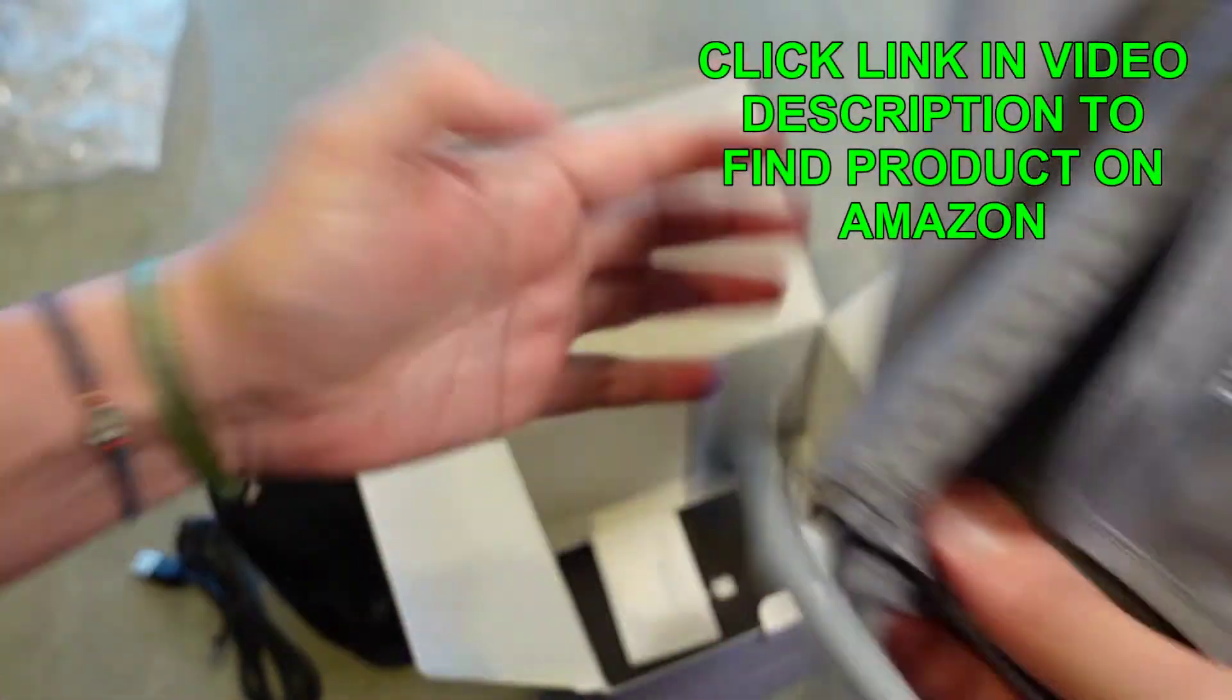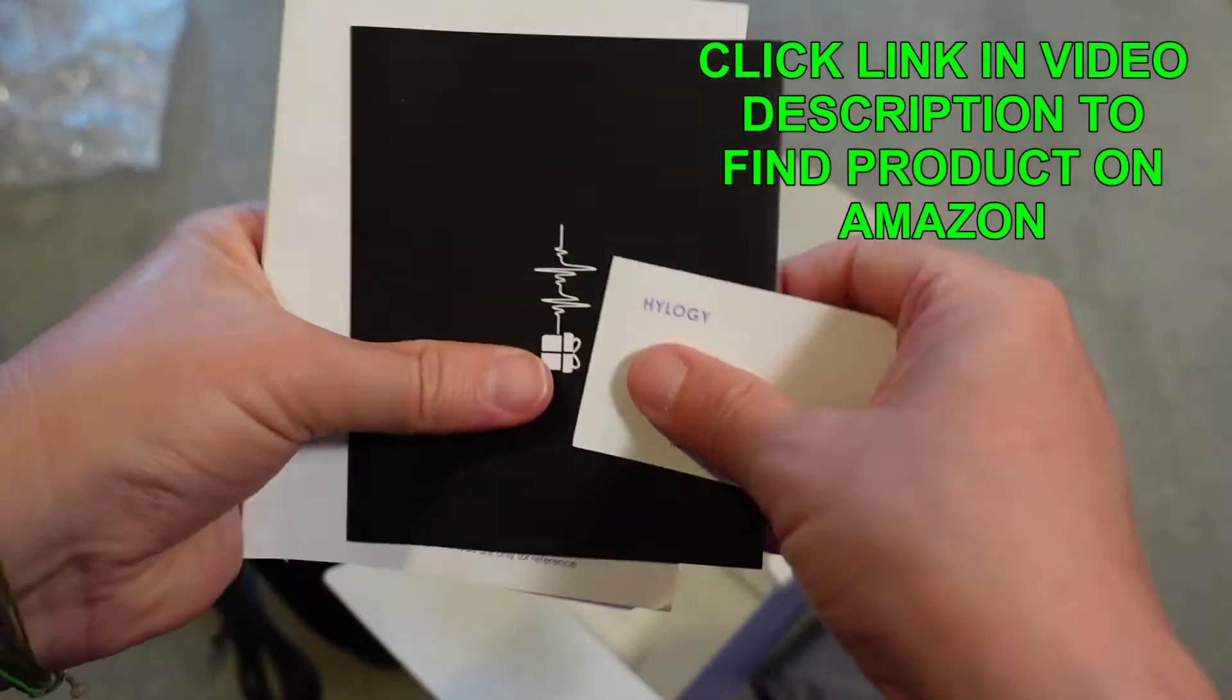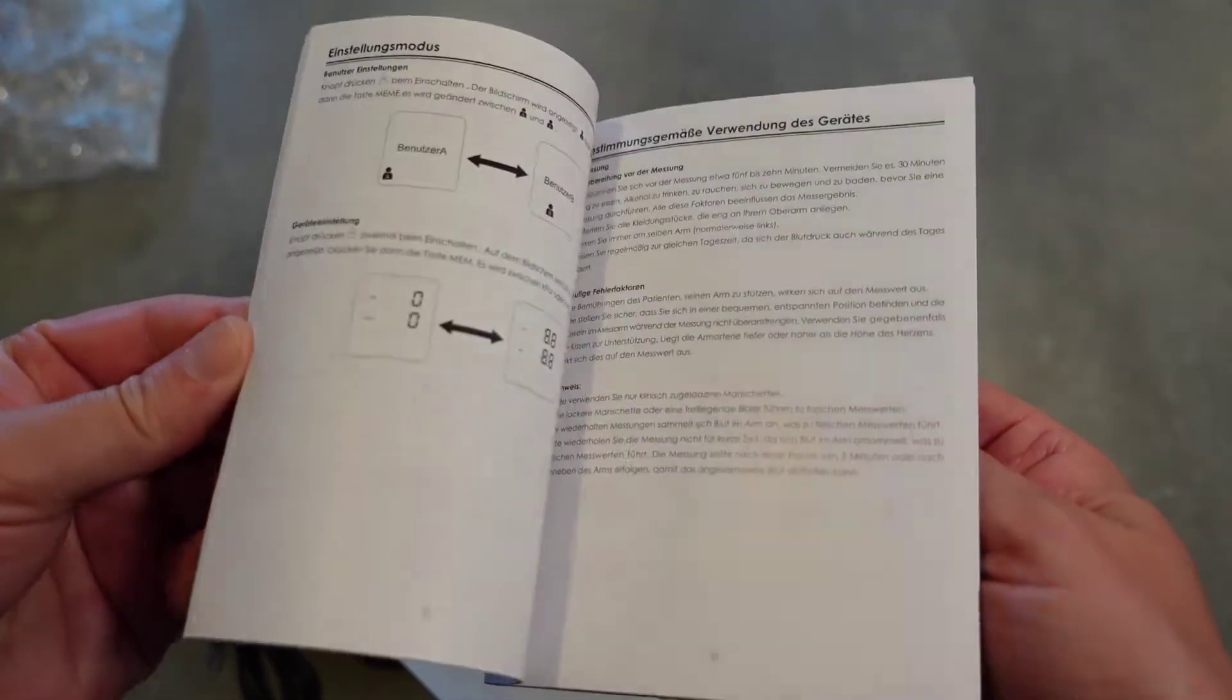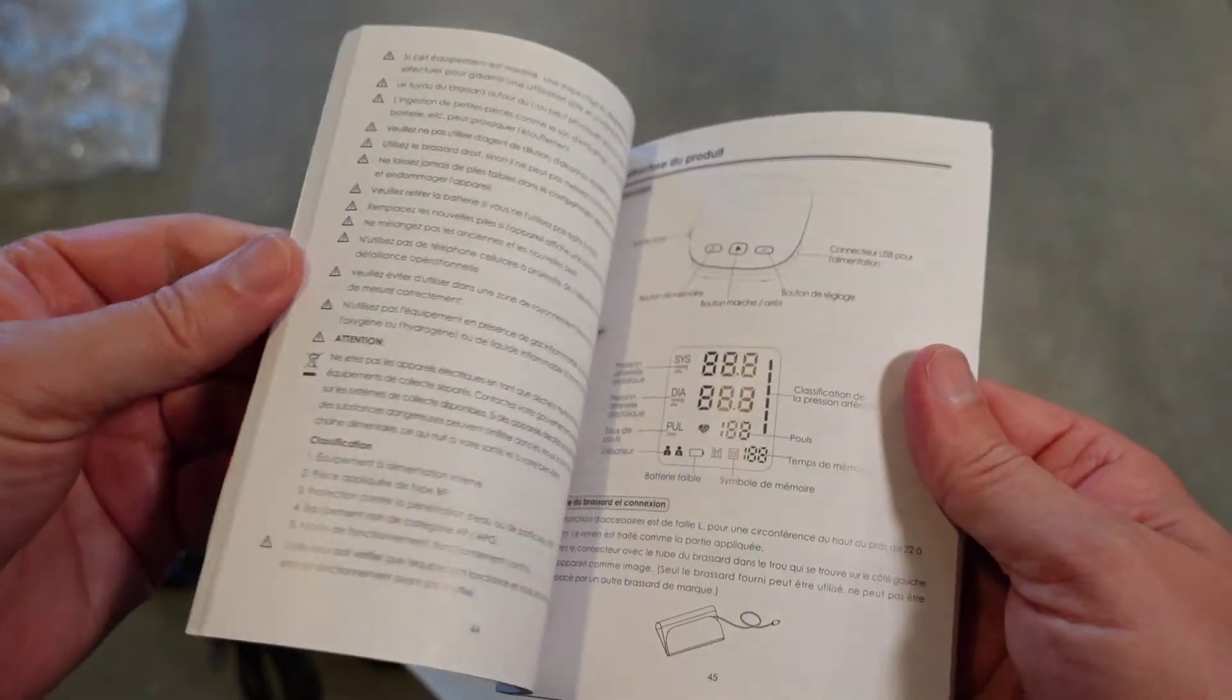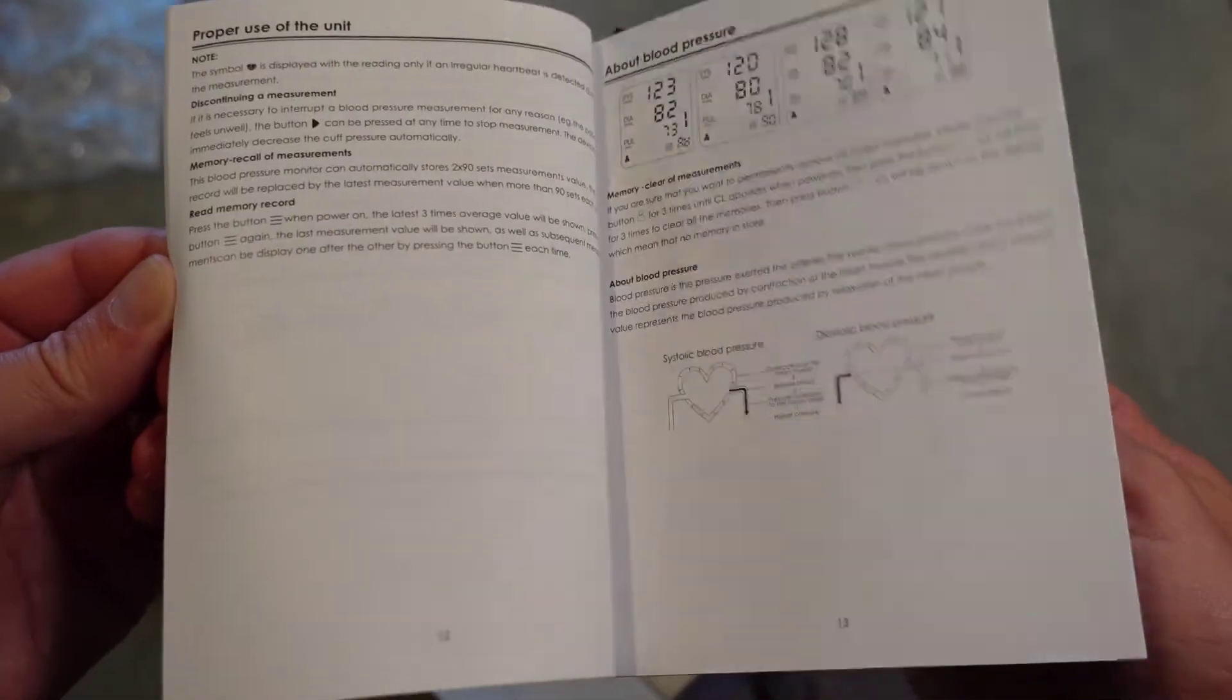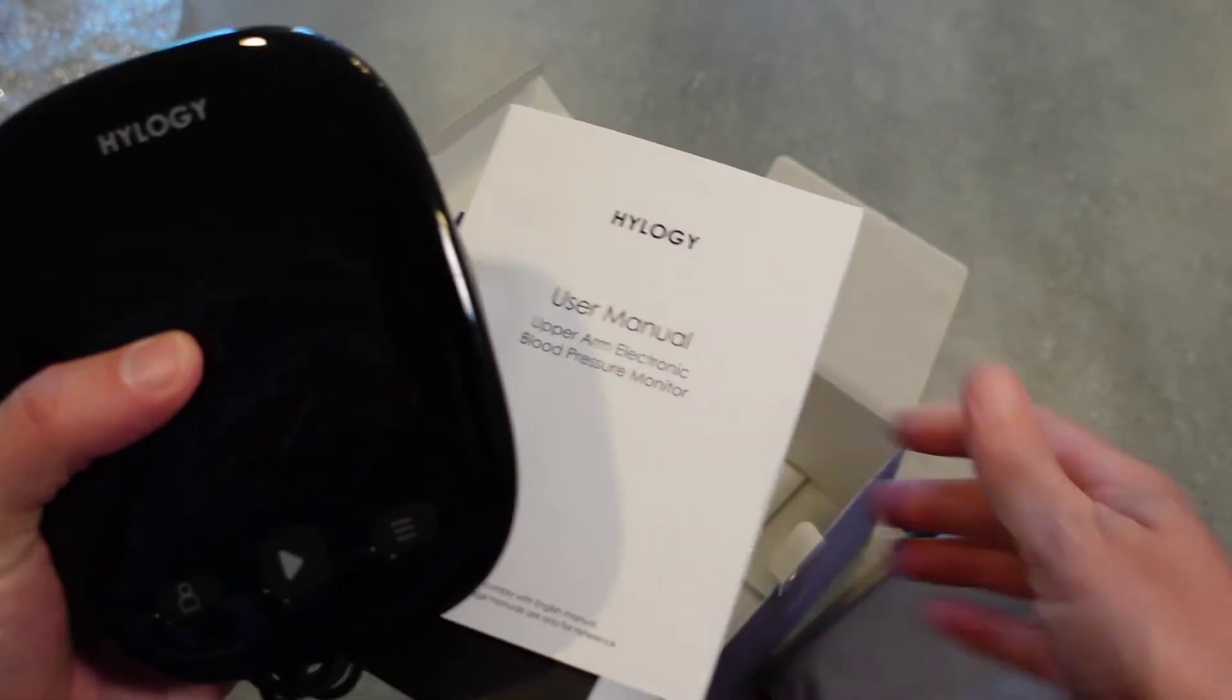And then of course you've got some instruction books, user manual in there to tell you how it all works. Because it does do quite a few things with the memory and stuff. So you've got your manual so that you can figure out how to use it. But that's everything that comes in the box.